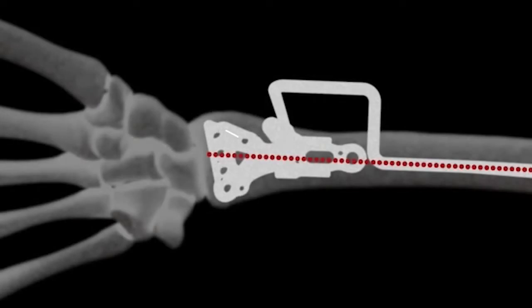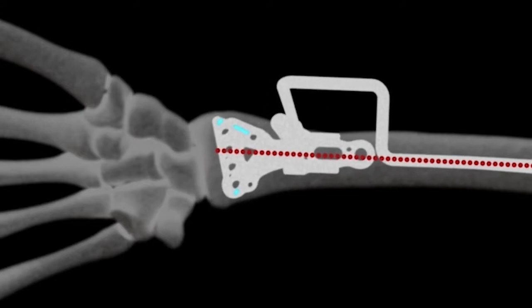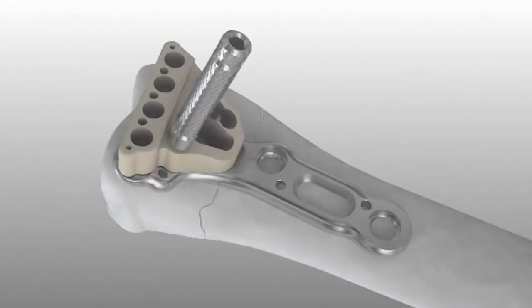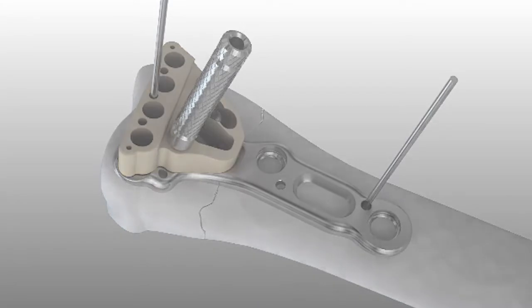Under fluoroscopy, the handle extends the length of the plate shaft's projection against the radial diaphysis in an AP view. This is used to accurately place the proximal shaft of the plate in alignment with the center axis of the radial diaphysis. The plate handle can be used in conjunction with the radiopaque styloid post and the targeting guide for precise plate placement. Once the desired position is achieved, secure the plate with 054 K-wires or plate tacks. Plate tacks can be used in proximal K-wire or screw holes only.